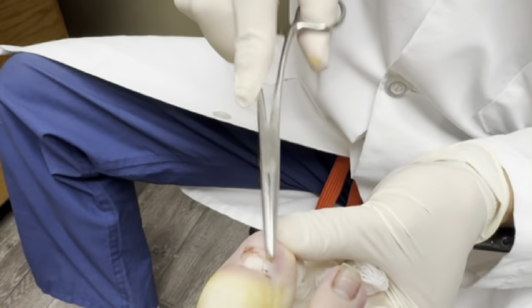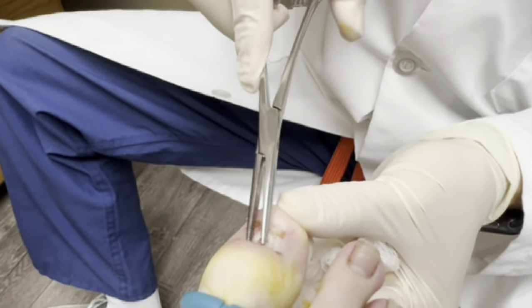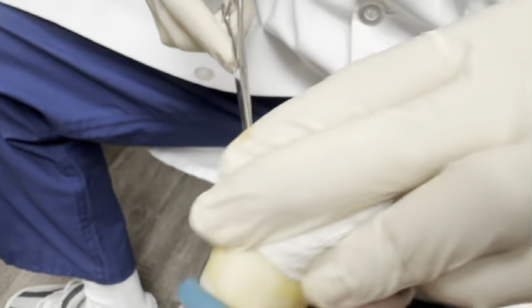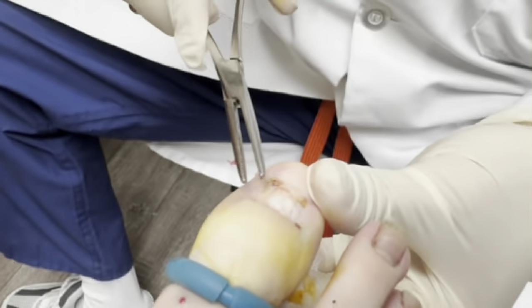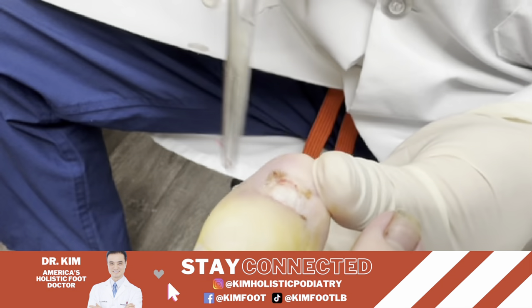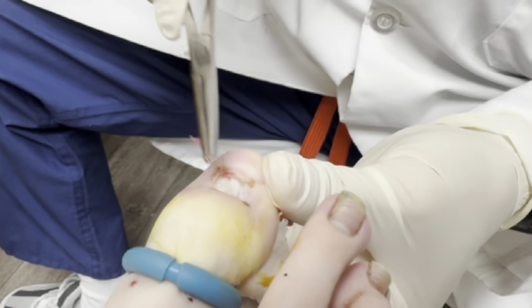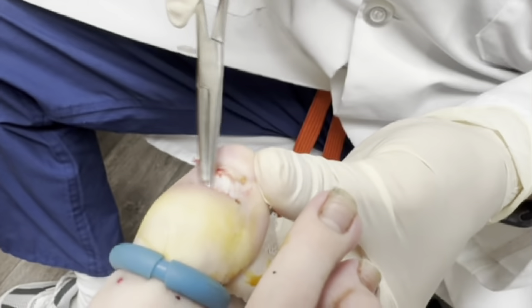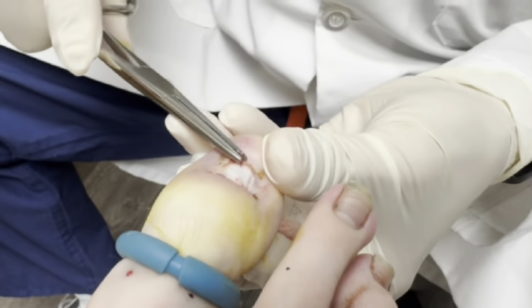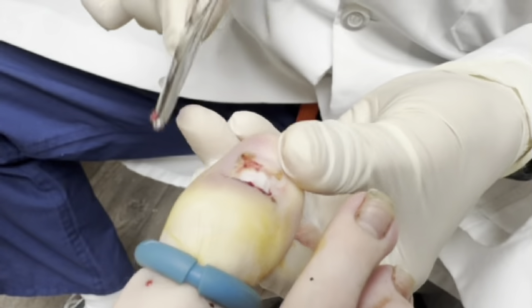Is it just white under there? Is there any nail growing? It doesn't look normal. So we just wanted to clean this all out and start new because it looks pretty clean now as you can see. Whatever doesn't look normal we send off to the laboratory. I think we're clean — you're good. There's a little tissue here that I may take off a little bit.